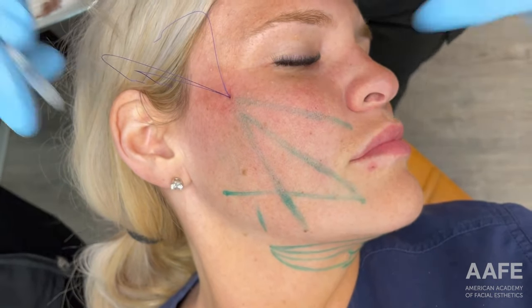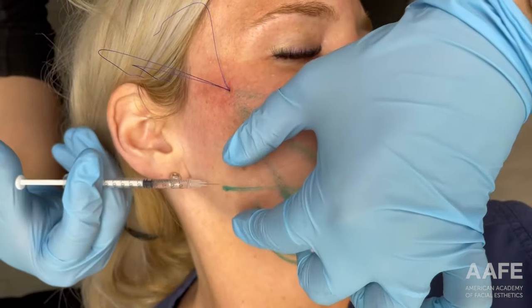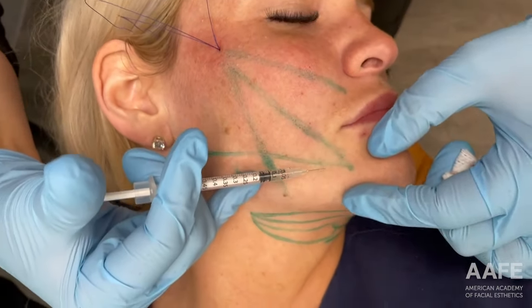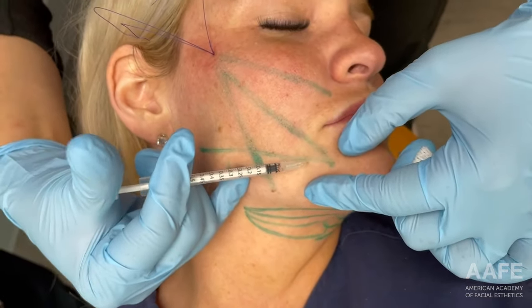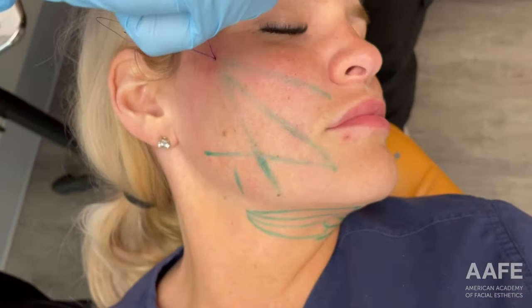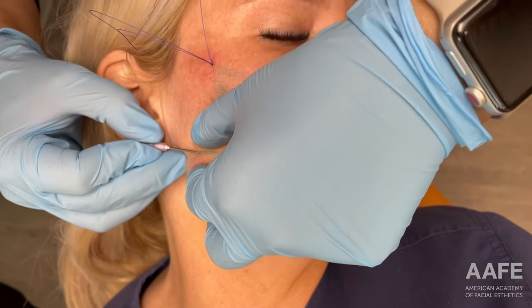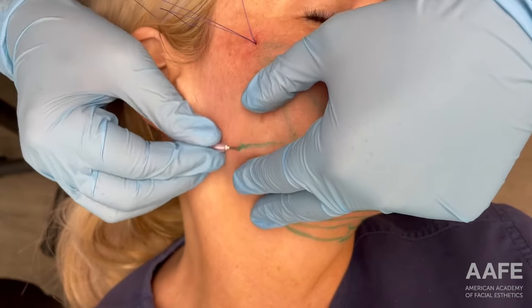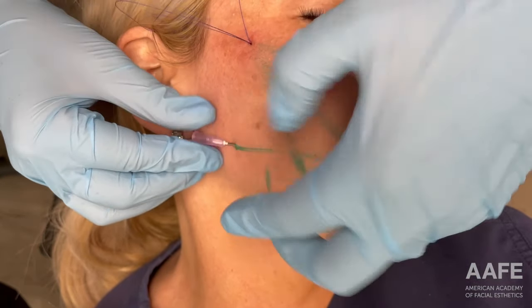We're going to move along to the jawline thread and then I'm going to sit her up and take a look to make sure I'm happy with the lift that we've achieved. She's an amazing patient — I don't think she's moved once. Are you comfortable? Okay.